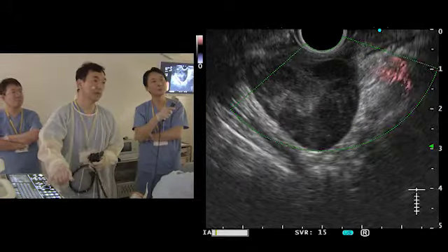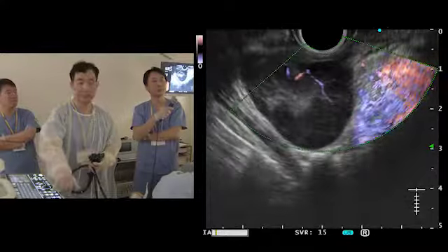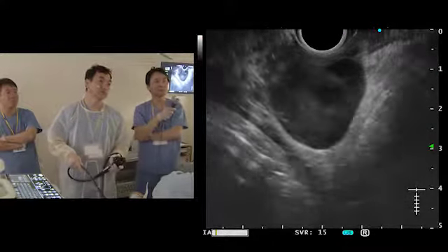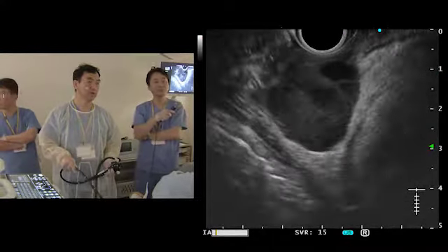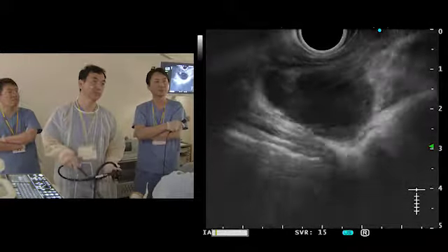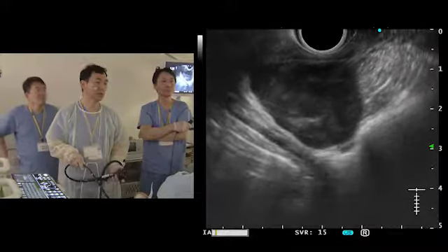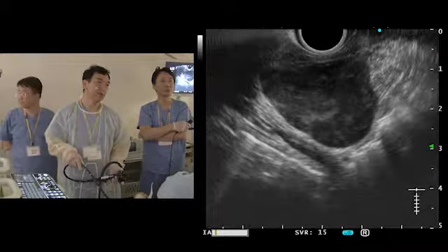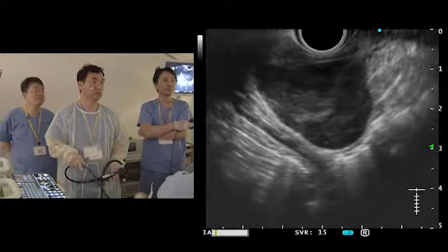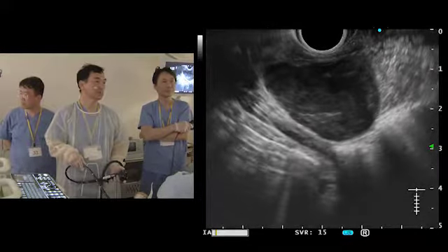There may have been intratumoral bleeding. Right. So as few biopsy passes as possible would be best for this type of tumor. But again, we have to get adequate tissue for immunohistochemical stain. So my bias is I always do at least two passes, as kind of an insurance package.